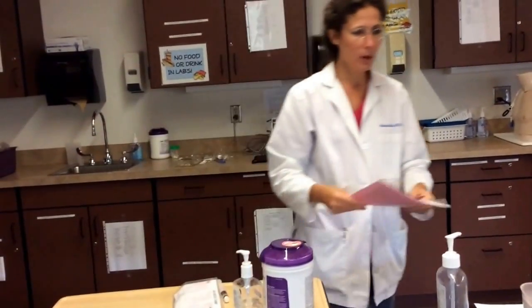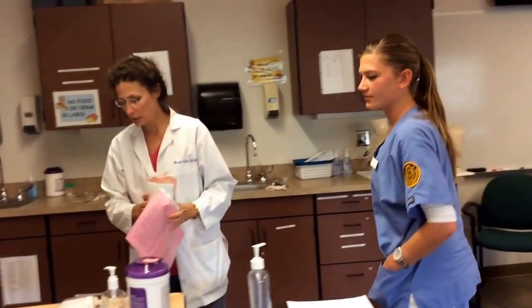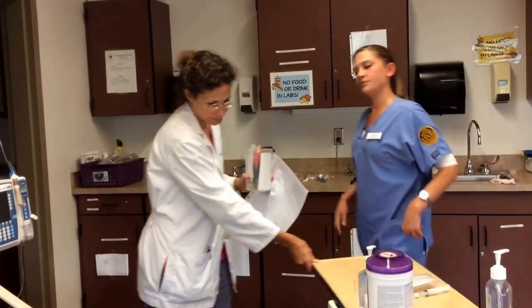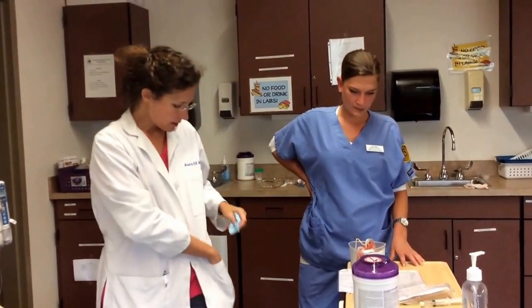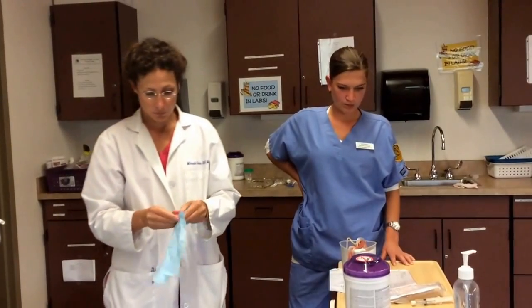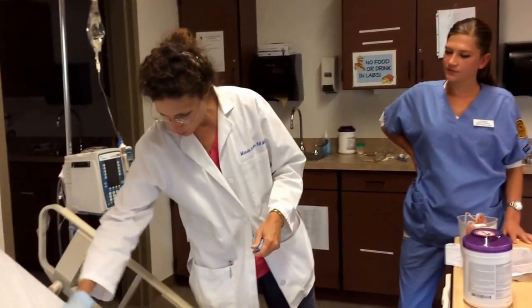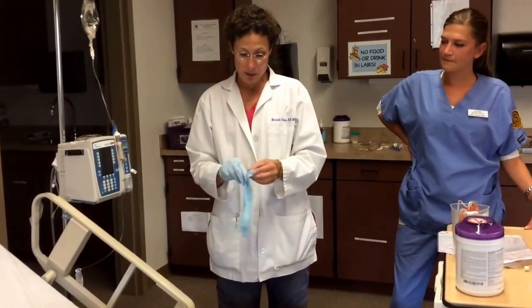Okay, so at this point, another RN or registered nurse needs to check the blood with me, so thank you, Alyssa. This is Mr. Smith. We'll just go into his room and get ready for this here. So come on over. Okay, I'll just put on some gloves because I'll handle the unit. Okay, Mr. Smith, we're back, and this is Alyssa, and she's going to go through checking this blood with me so we can get this started.